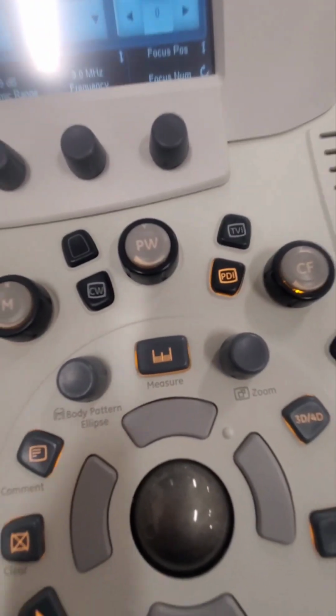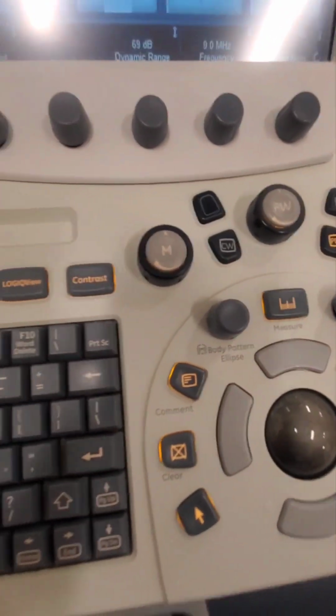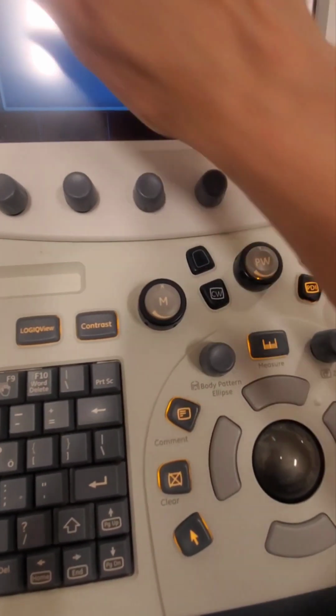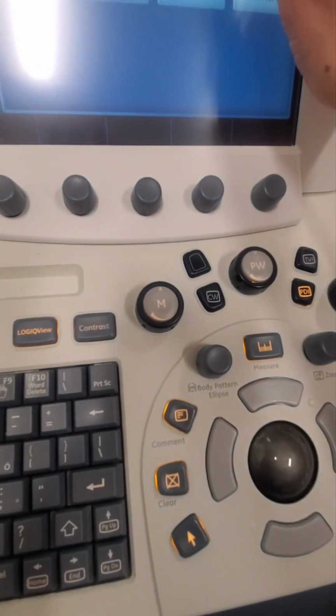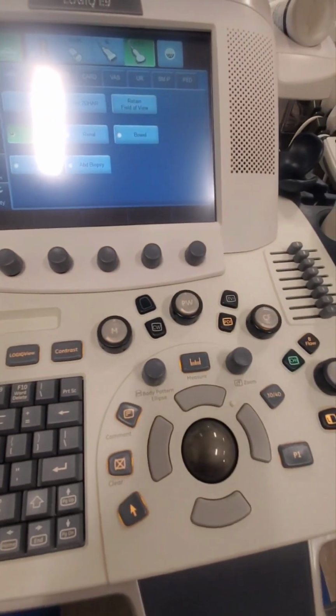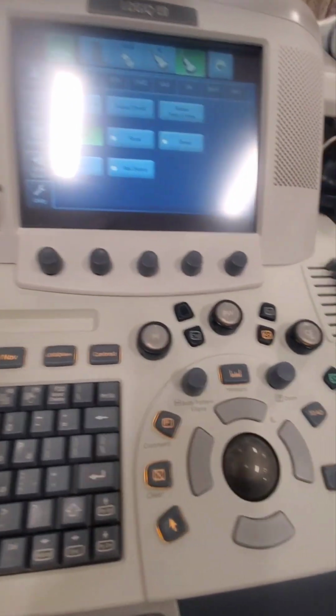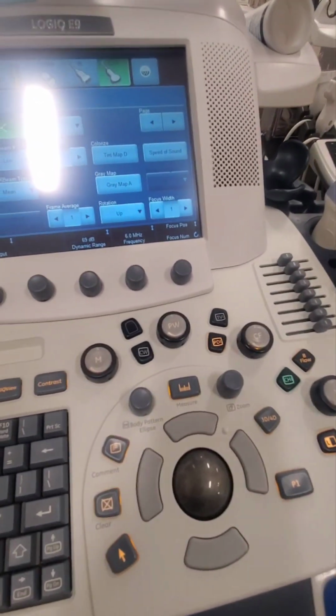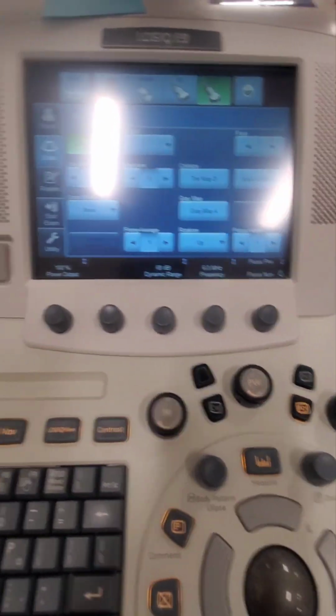Velocity information. So that's your B mode, your color flow, your pulse wave. Okay. The other one is an M mode, and I will show you that one. Usually we use that when we're scanning OBGYN. Echo might use it because we use it to scan the heart.